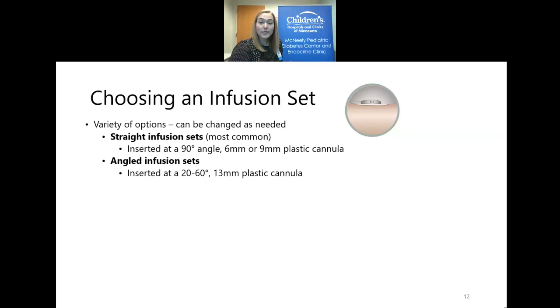For the angled infusion sets, some of them are manual insertions, so you would yourself be holding that needle to insert it at the angle you prefer. And some of the angled infusion sets do come in those preloaded insertion devices, so there is flexibility with that as well.